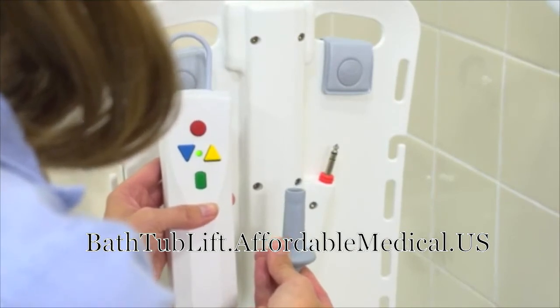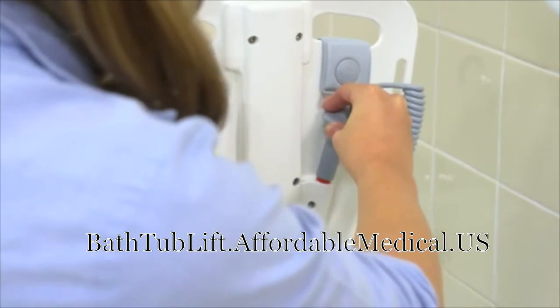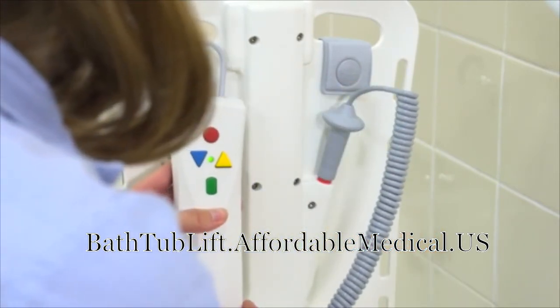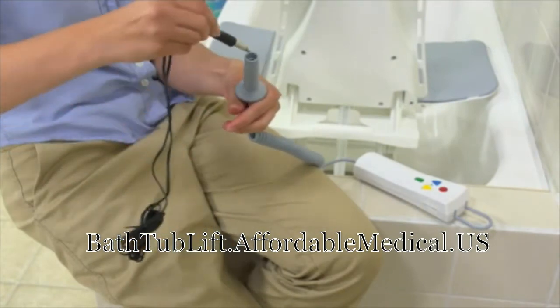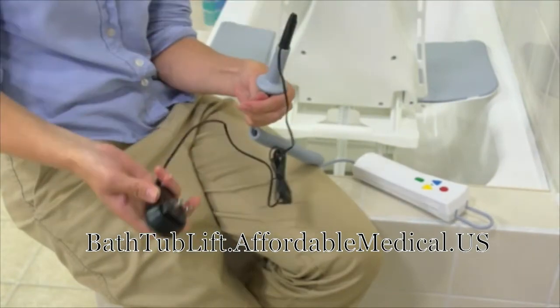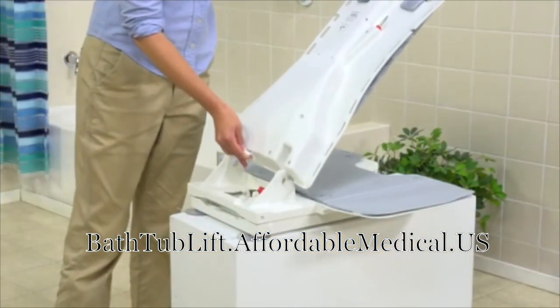The Bella Vita is also equipped with a smart battery that ensures there is enough power to lower and raise the user, preventing the user from remaining in a lowered position for too long. Charging the battery is a breeze, as the hand control can easily be unplugged from the bath lift and connected to the charger.